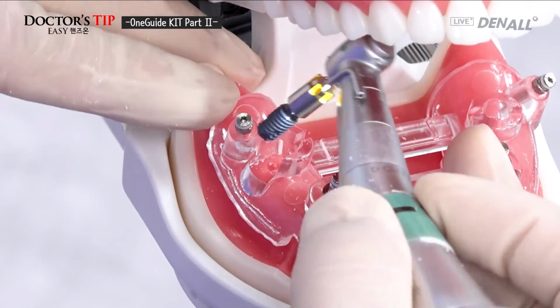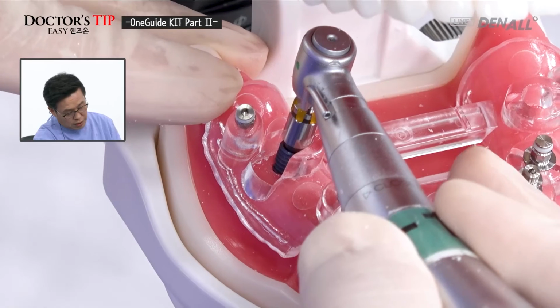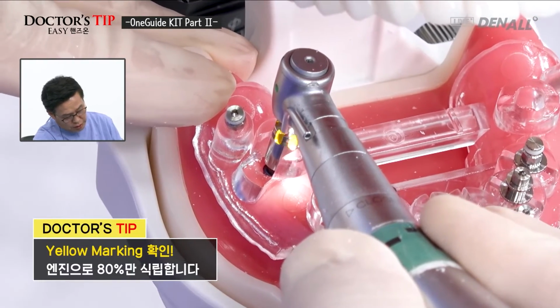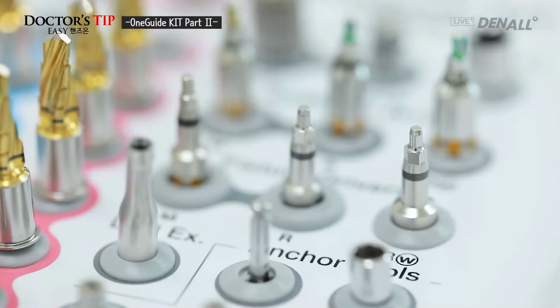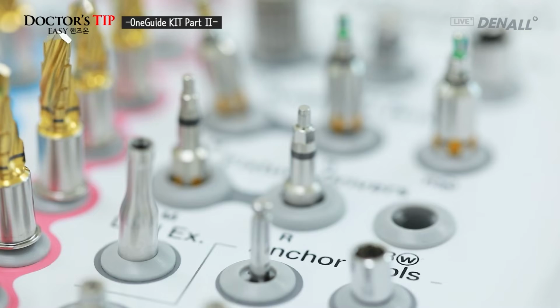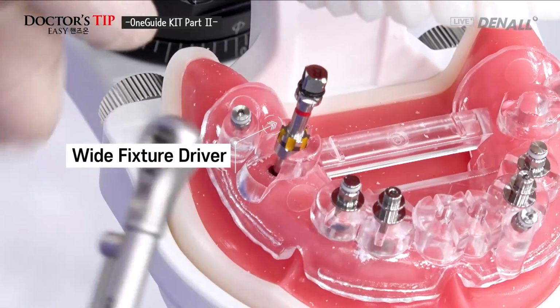5.0 by 8.5 millimeter fixture is chosen. Because this is open type, you need to make a contact, and the fixture is going to be placed approximately 80%, and then remove. On the fixture driver, wide type, wide hole fixture driver is chosen. Check whether it's well connected.